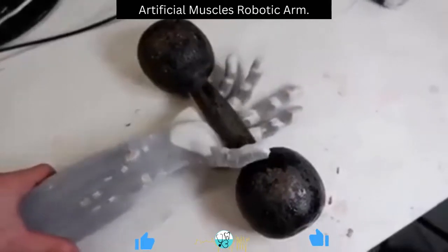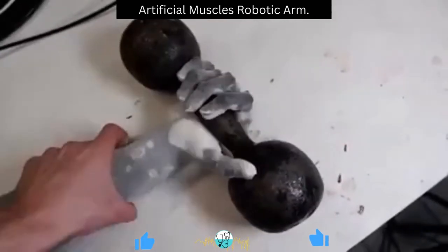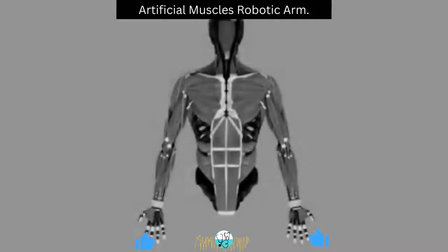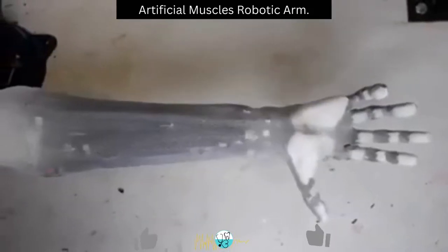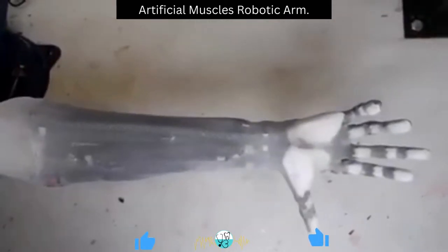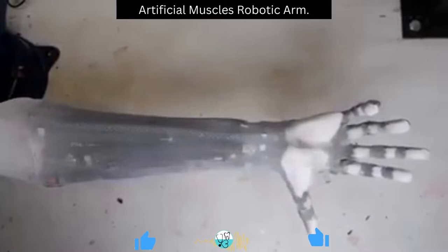Have you ever seen a person with amputated limbs? Can you imagine how difficult it makes their daily activities? Different prostheses have been introduced, but none of them has been able to be as efficient as God-given hands, and they can never replace natural hands.